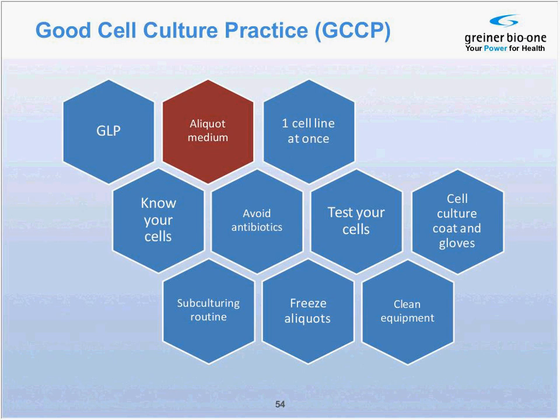You should aliquot your medium because, one, you wouldn't bring contamination into the whole medium bottle, and second, you should also warm up medium only as aliquots, because if medium is not used by amount, then the frequent warming might lead to instability, for example, of glutamine, and therefore it's best to aliquot the medium. You should handle only one cell line at once in the cell culture hood.